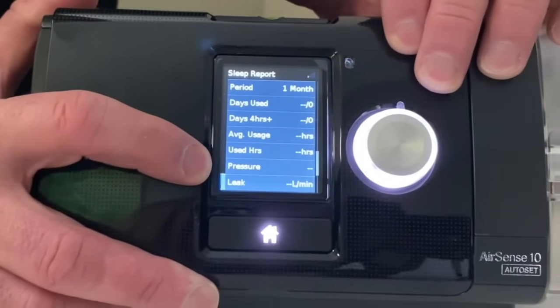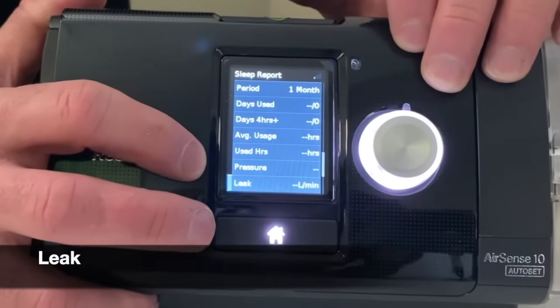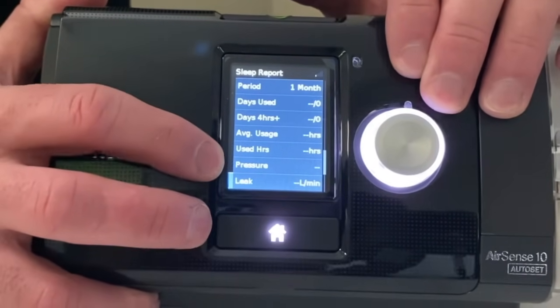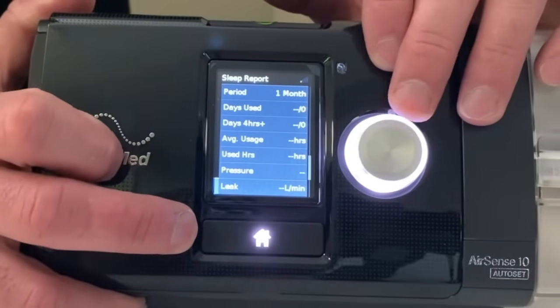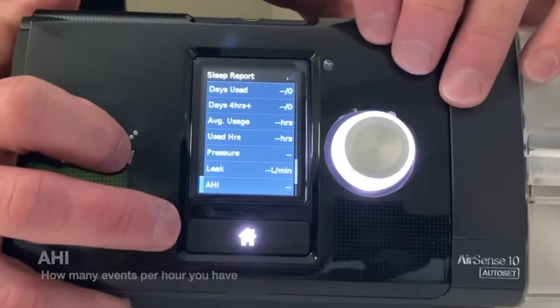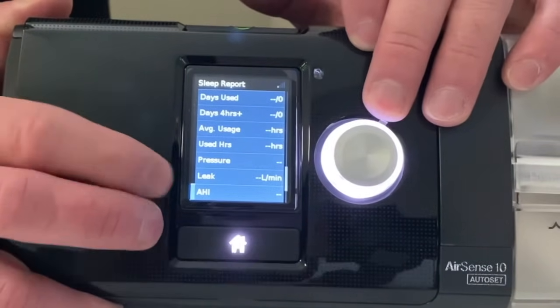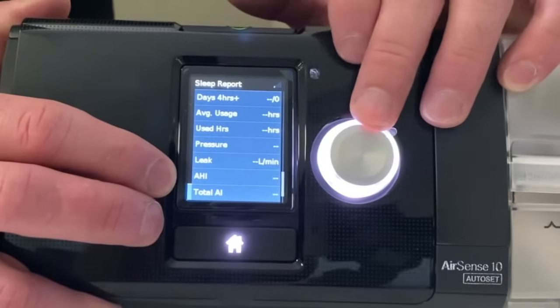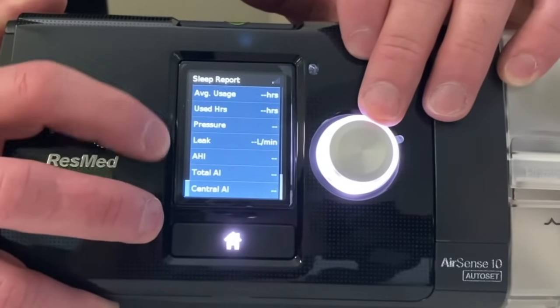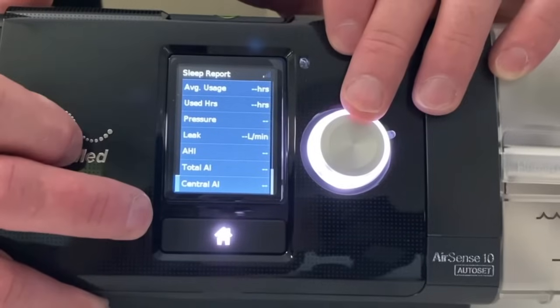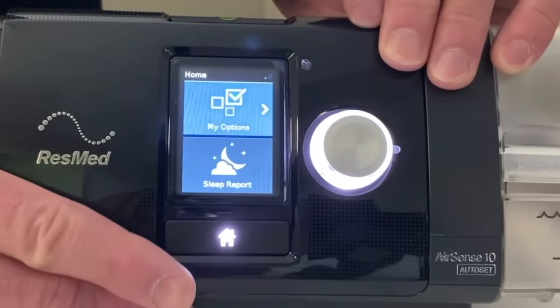The next one down is your leak. Above, we had a smiley/frowny face for the seal, but this tells us exactly how many liters per minute of leak — and typically we want to keep that below 24 liters per minute. Next one down is your AHI, which is how many events per hour you have. Scrolling down further, it splits out into multiple different parts of the AHI, showing what types of events you're having. Then pressing the home button takes us back out.